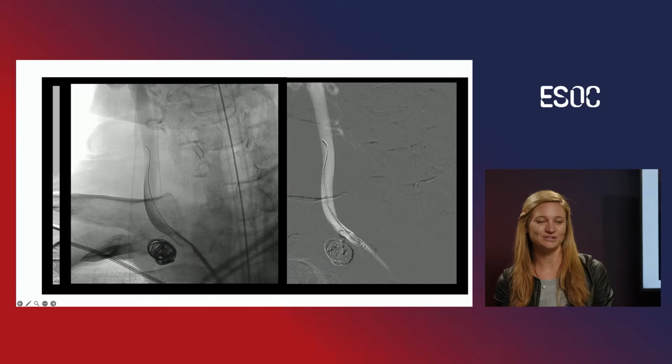But you do not actively aspirate during this coiling procedure? No, there's too much blood that comes back. It takes time, actually. It takes time. That was the result of that coiling.